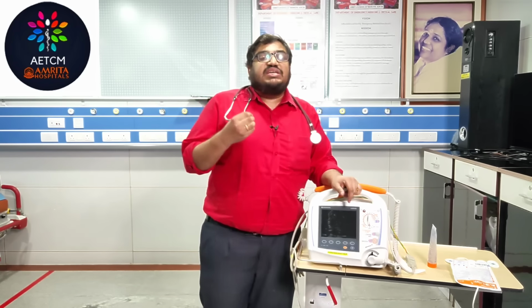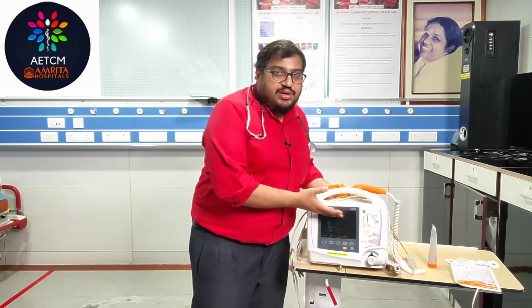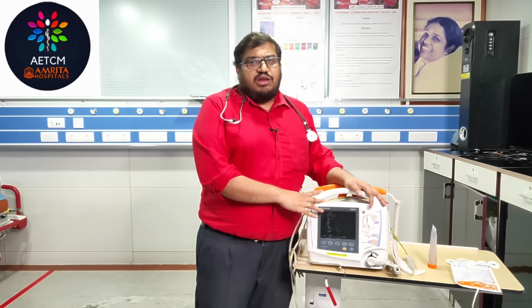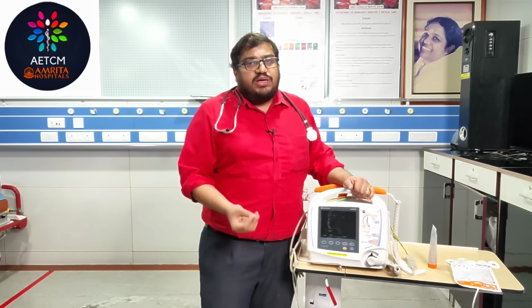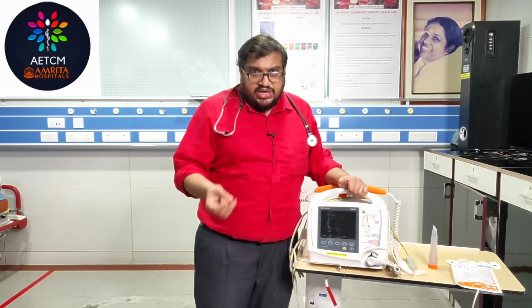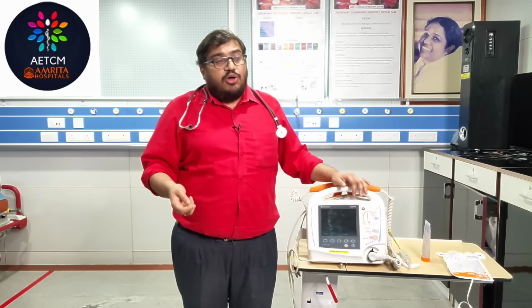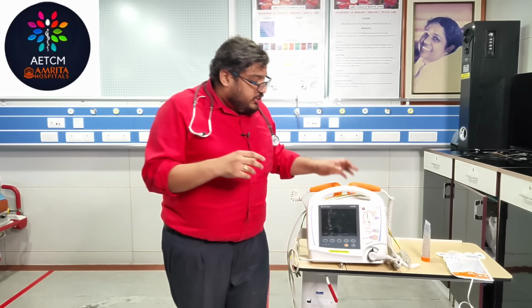So what are the things that are needed before you decide to defibrillate? It is mandatory to have a defibrillator. Yes, you need a biphasic or a monophasic defibrillator. There are a lot of brands of defibrillator available. Make sure that it adheres to the protocols and is approved by the government of India or whichever regulatory body your country has. That is one most important thing, because there are a lot of substandard defibrillators available. Sometimes the shock will not be delivered, or it might be harmful to the doctor who is going to deliver the shock. So first of all, you need a defibrillator.